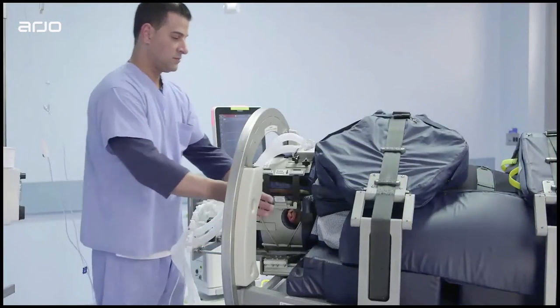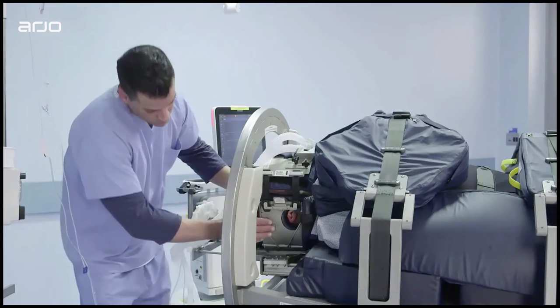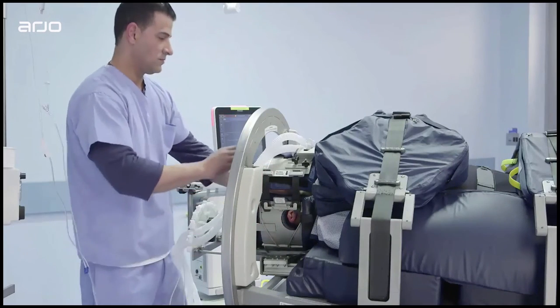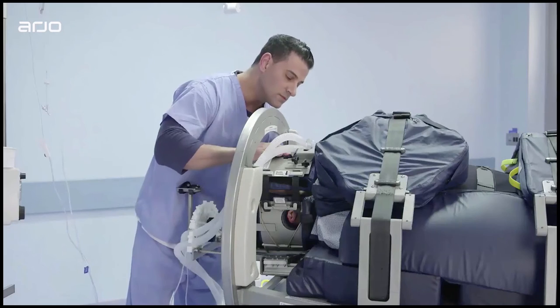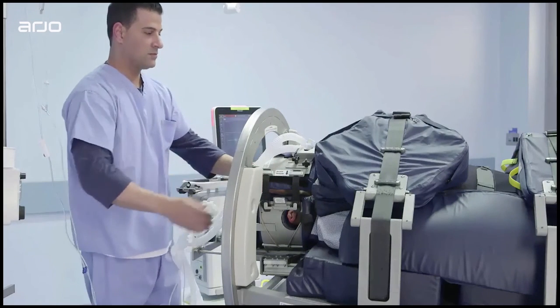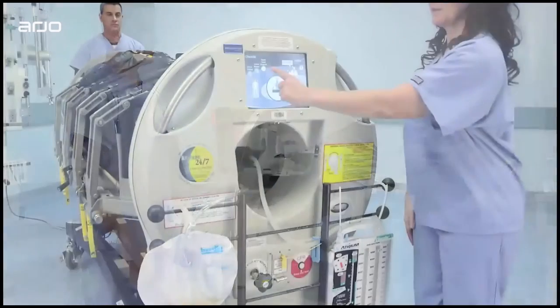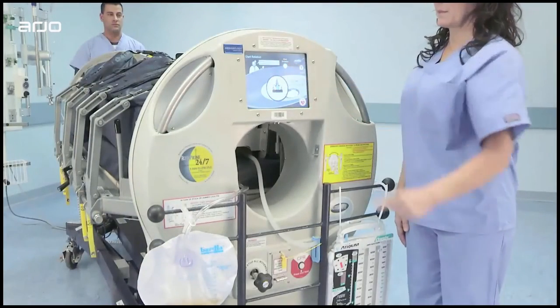Third, examine the patient's placement in the head support assembly. Ensure the patient's ears are aligned with openings, the eyebrows are aligned with the top opening of the face mask, and that the face mask straps are securely tightened appropriately. Once the patient's head is clear, press the Check Head Support button.